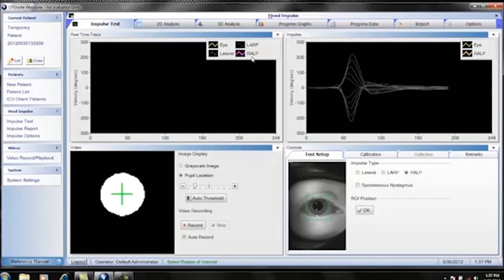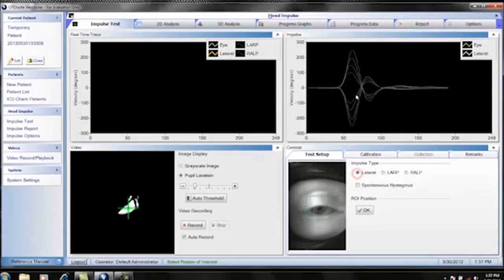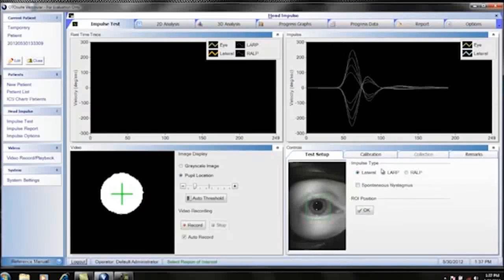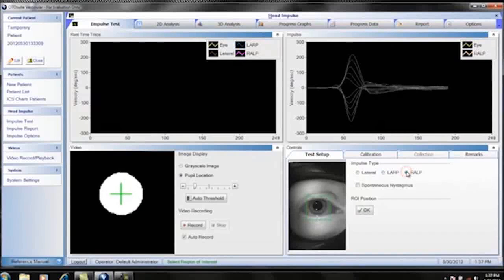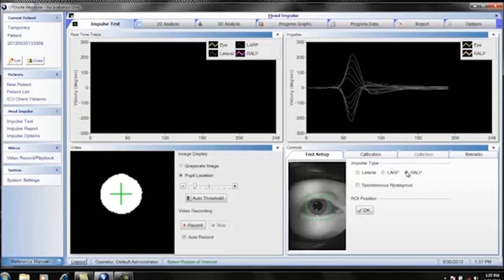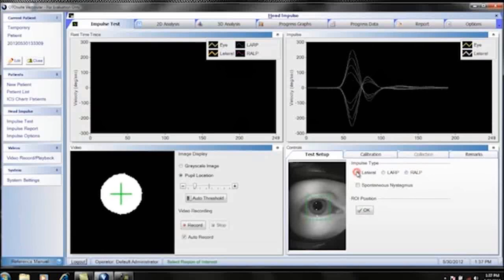The other thing I want to point out is, let's go back to lateral and look at the training curves. When I choose lateral, then when I choose LARP and RALP, they're changing. So you have to make sure you choose the correct test for what you're getting ready to perform on the patient. Let's go back to lateral.